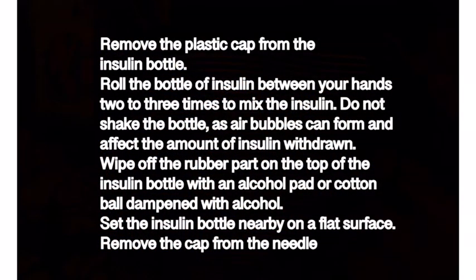Remove the plastic cap from the insulin bottle. Roll the bottle of insulin between your hands two or three times to mix the insulin. Do not shake the bottle, as air bubbles can form and affect the amount of insulin withdrawn. Wipe off the rubber part on top of the insulin bottle with an alcohol pad or cotton ball dampened with alcohol.